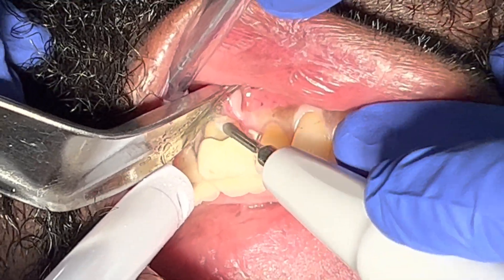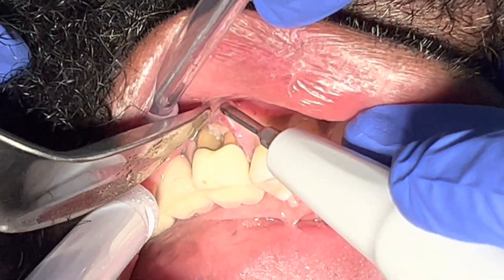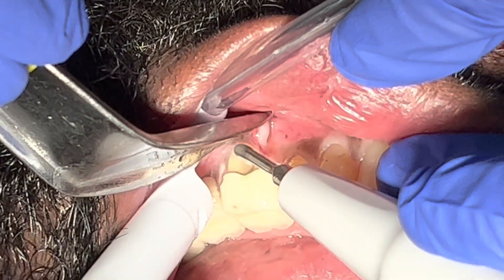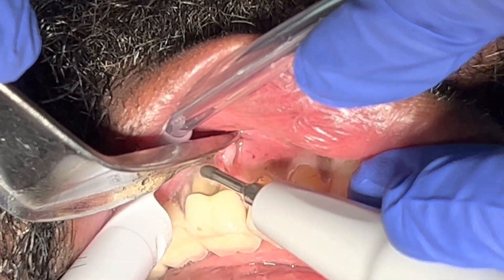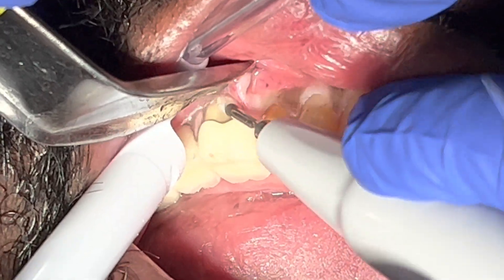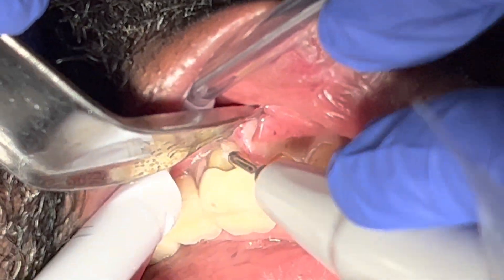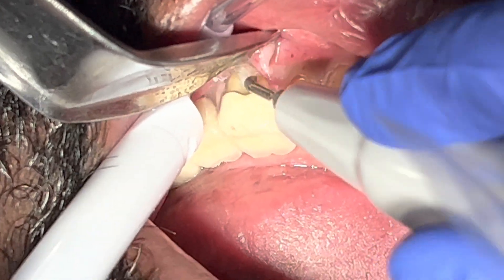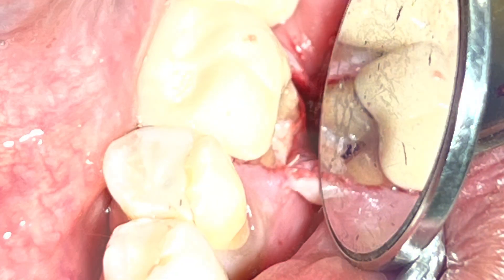I don't see much calculus — this patient actually has good dental hygiene and maintains very well. I keep examining that area to see whether I'm able to clean everything so I can graft this area with bone graft, achieve primary closure, and hopefully place a membrane as well to prevent the epithelium layer from migrating in.